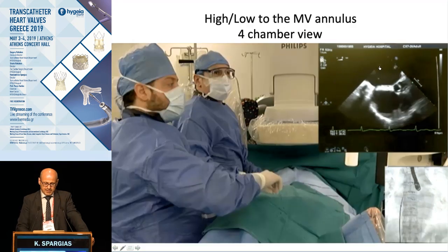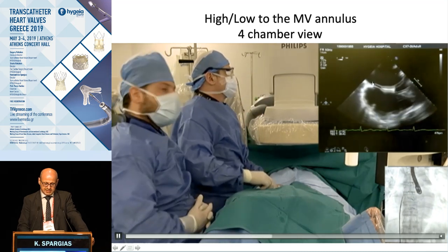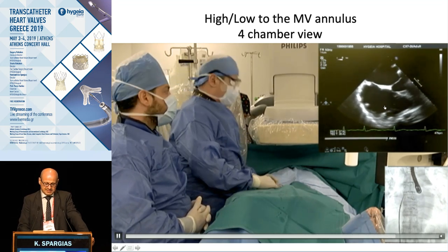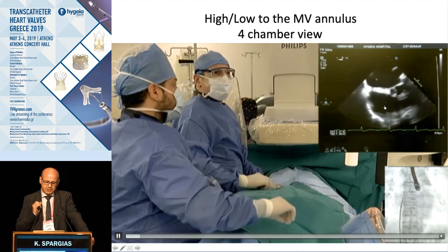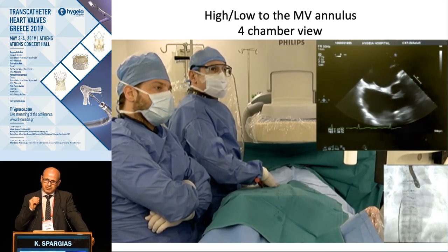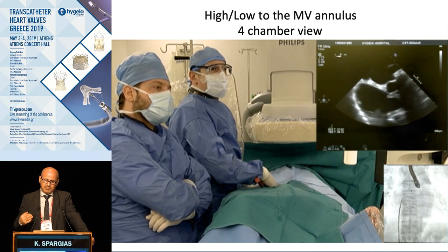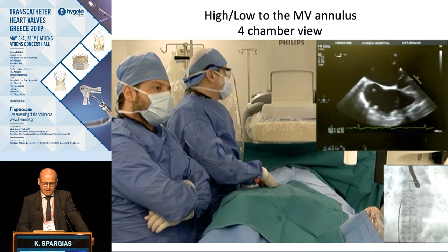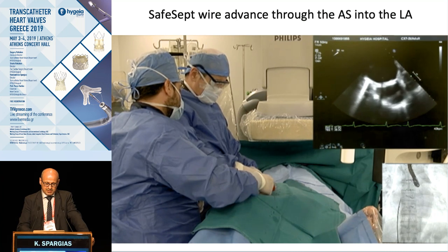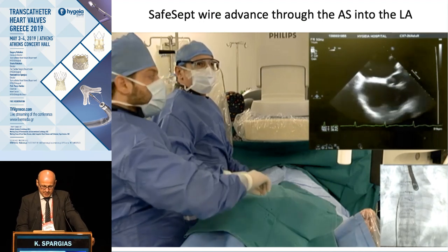Here we check the anterior-posterior in the short-axis at base view — we are in the middle. Here we check the height in the four-chamber view — we are as high as we can be in relation to the mitral valve. When we are completely satisfied, this is a very crucial part of the procedure. If you get this wrong, the procedure goes wrong. And if you are not careful, you can cause a pericardial tamponade.